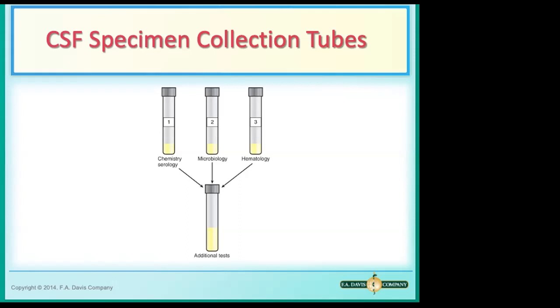Okay, this is where you need to do your testing. And it's not comfortable for the patient. And because of all of the complications that can occur during the specimen collection, as an MLS, when you're working on these specimens, you have to be extra careful.